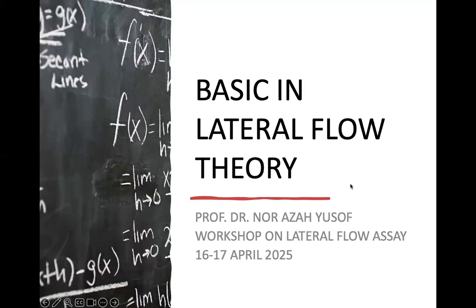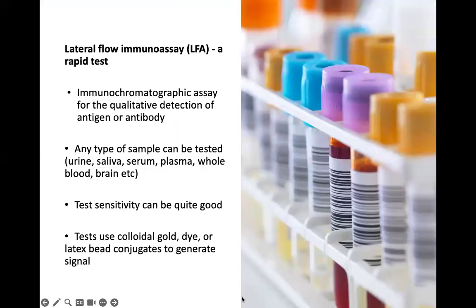So the first part is going to cover a very basic structure of the lateral flow, usually known as test strip, the rapid test kit. There are other names, but the standard name is lateral flow. So what is actually lateral flow?